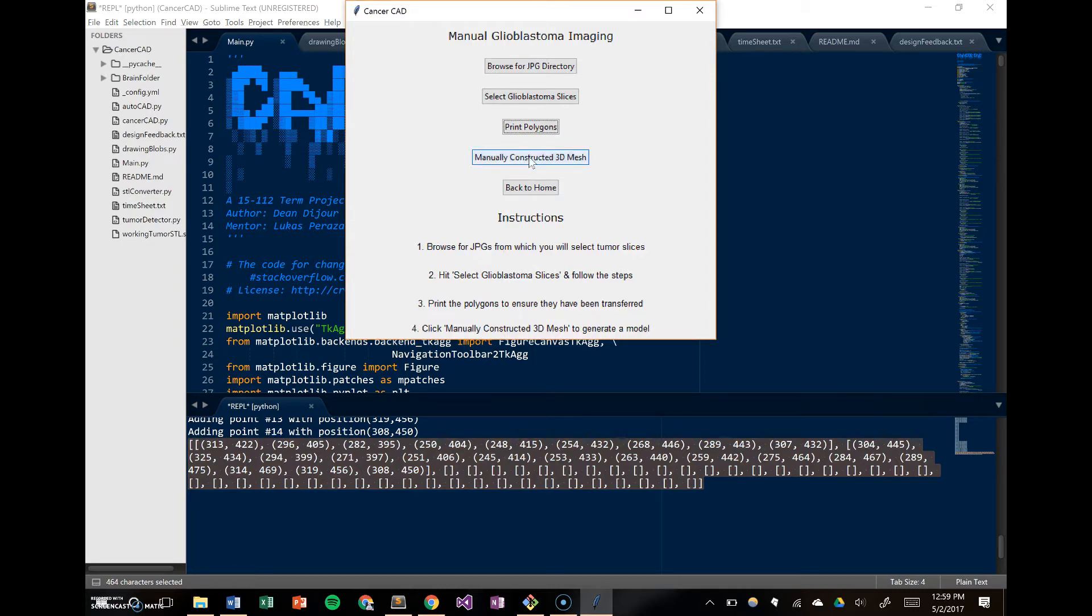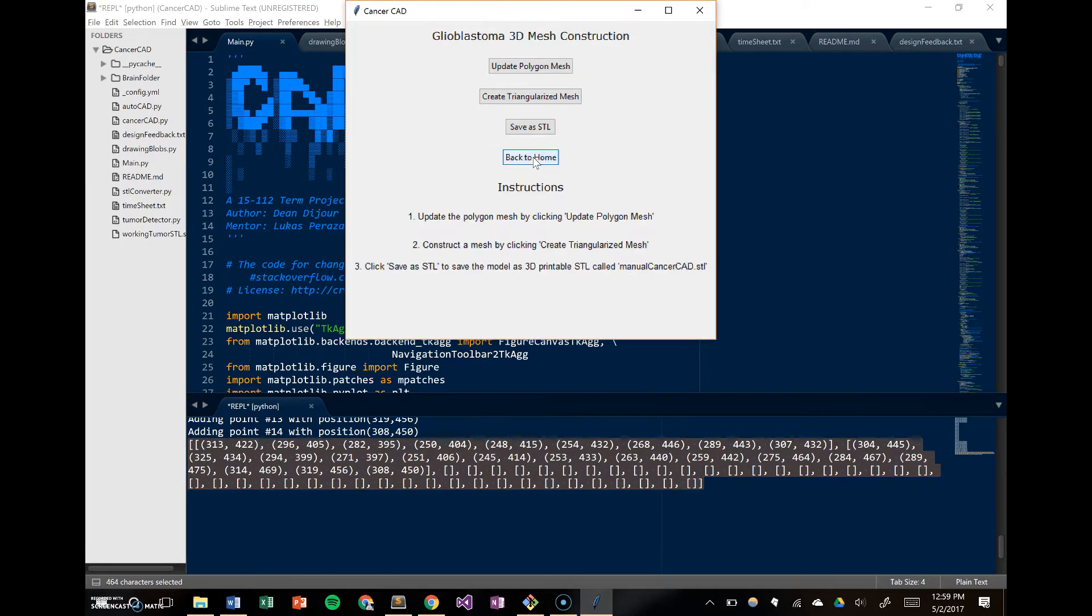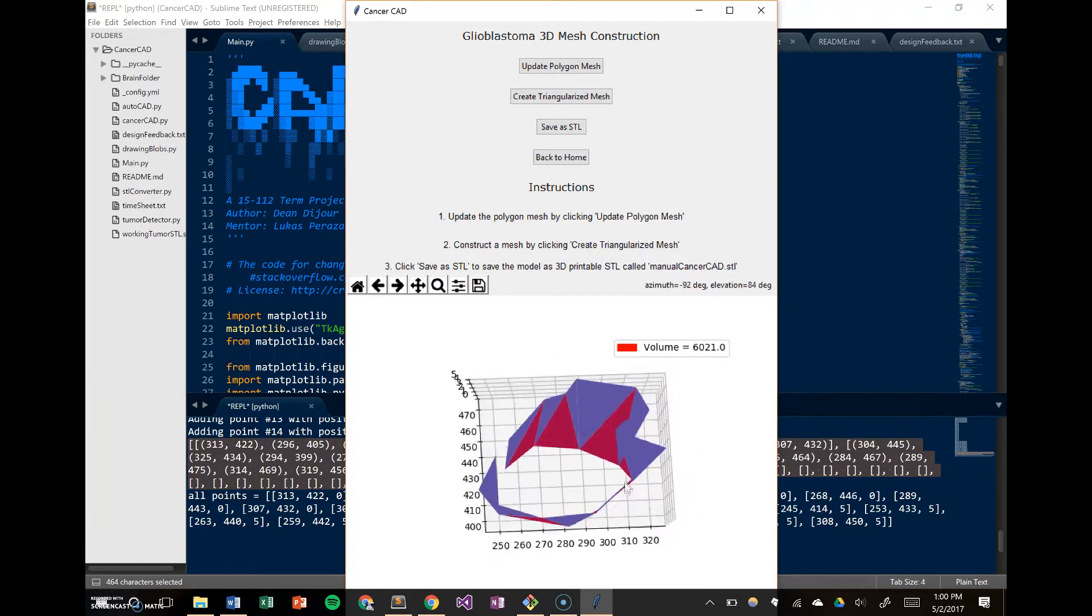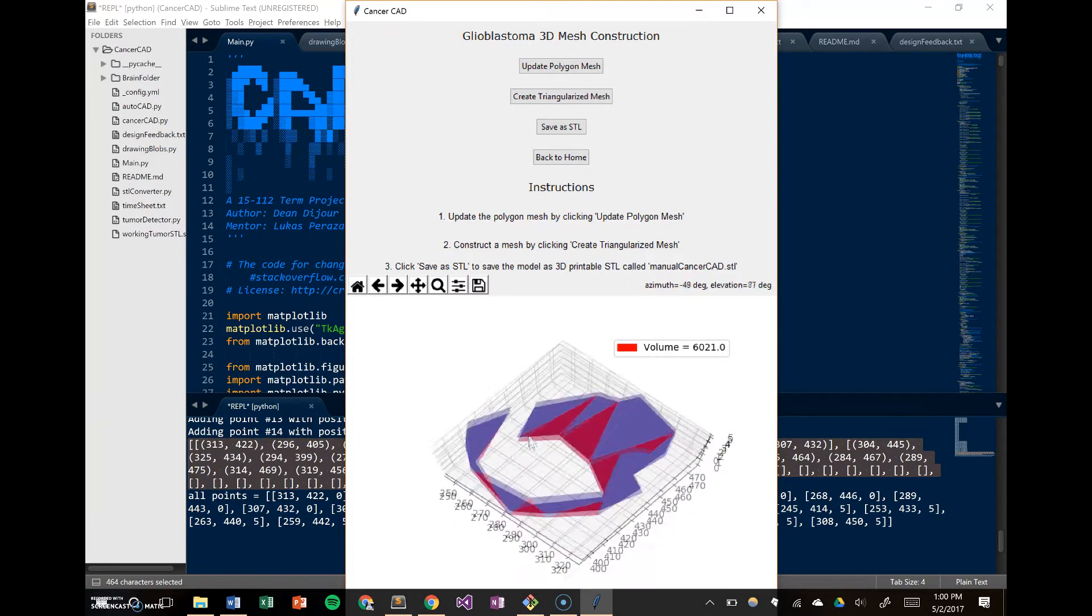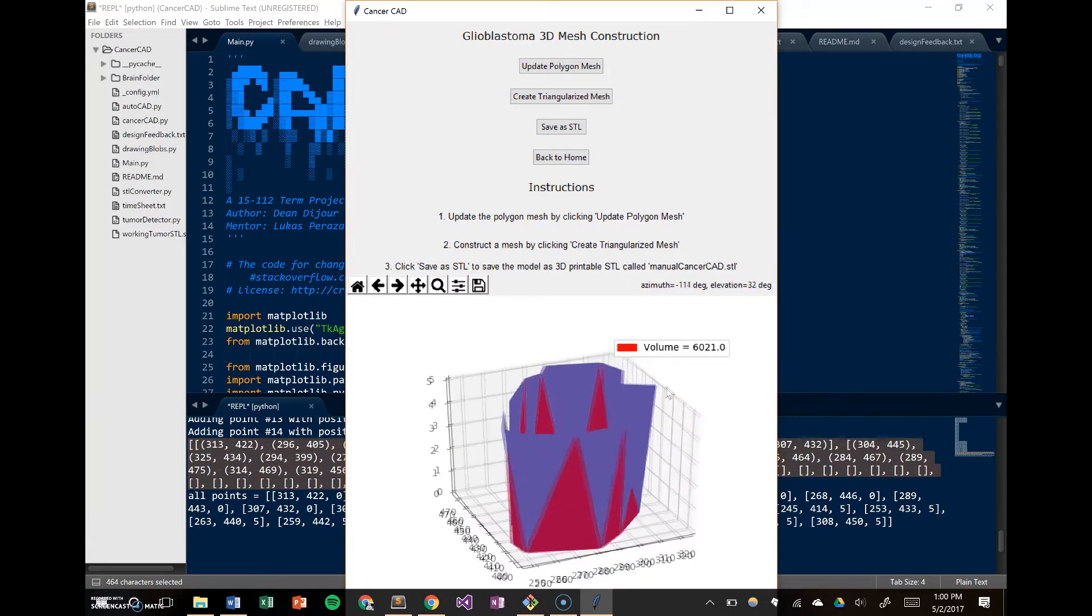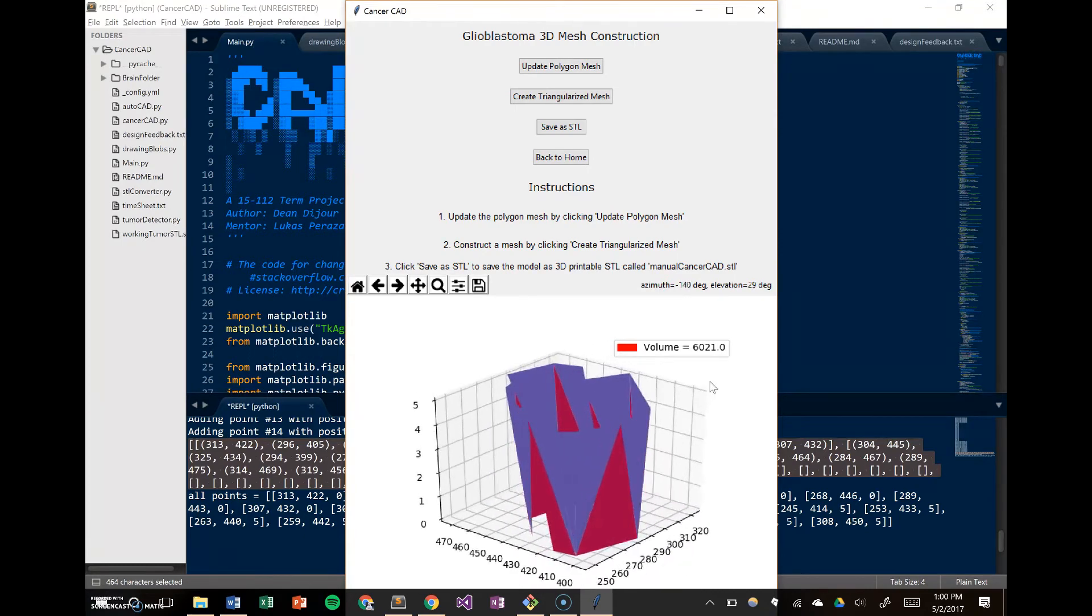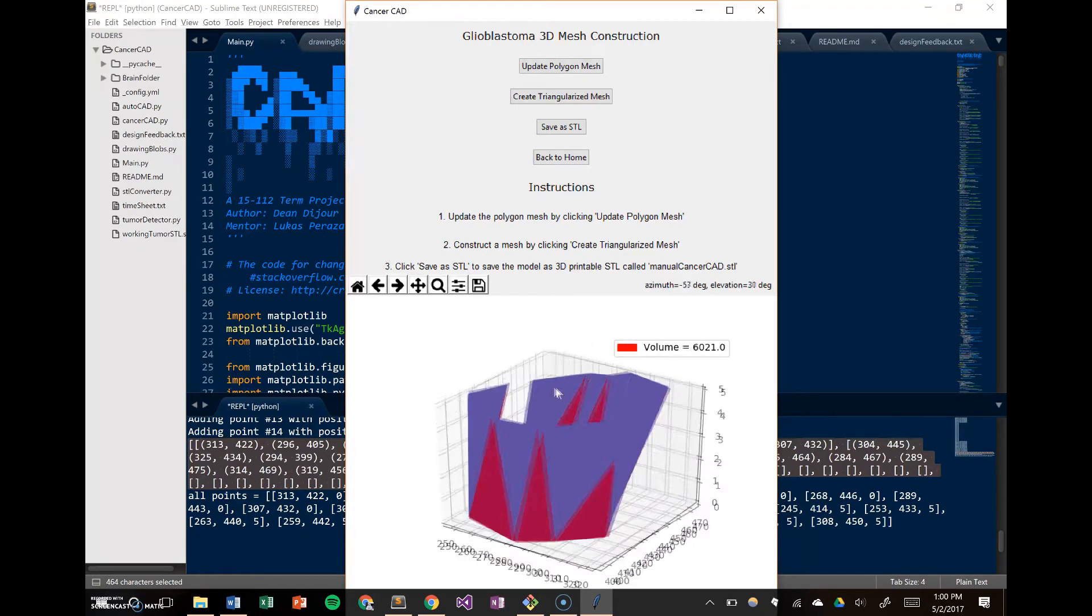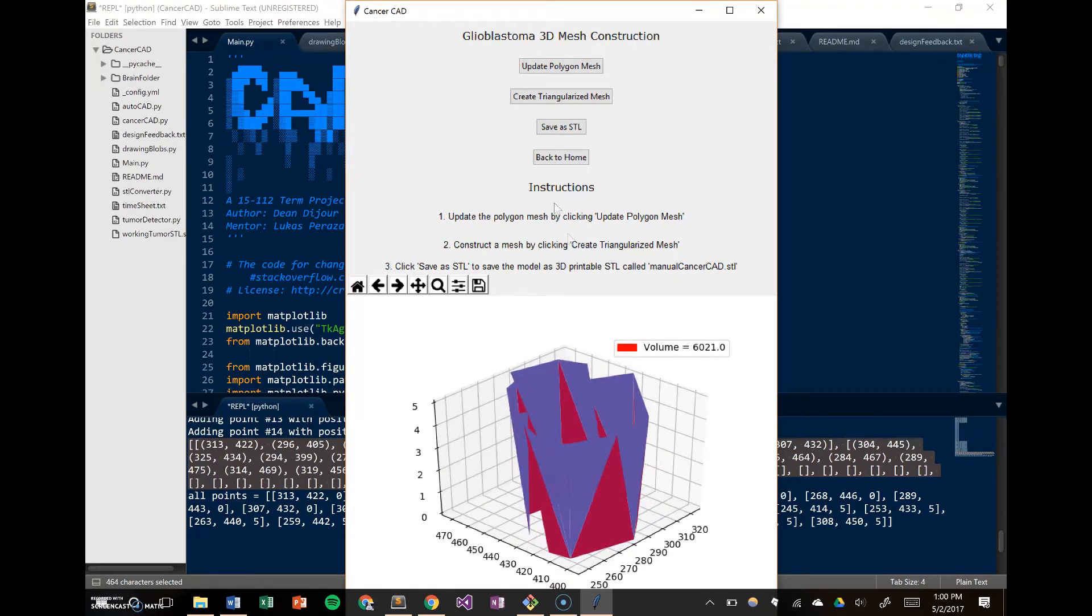So then we can construct the mesh. We first update the polygons, then we're going to create the triangularized mesh. It's going to show up here as a bunch of triangles, essentially just different colors meshed together. This isn't very meaningful because we only went through two slices, but as you'll see later, if you go through every single slice, you can build up something that's pretty easy to understand and look at.